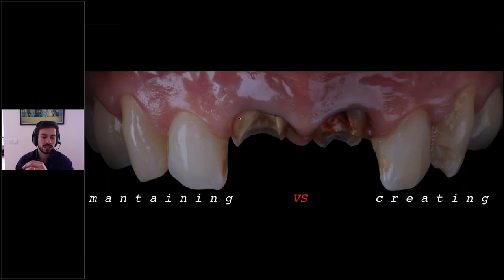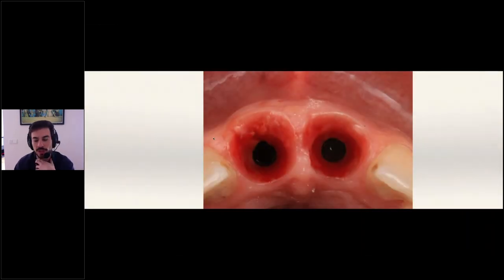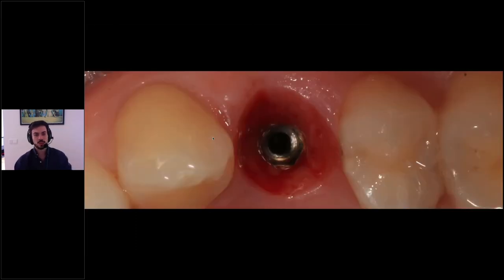So if we have this kind of emergence profile, we should try to maintain it. And at the end, with only one surgery and one provisional restoration, the result will be like this, like Mother Nature did it. The buccal volume is completely maintained, the keratinized tissue is completely maintained, and this is due to the presence of the buccal part of the root in this alveolus, and the implant is completely behind that root.